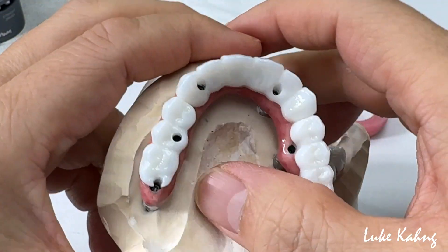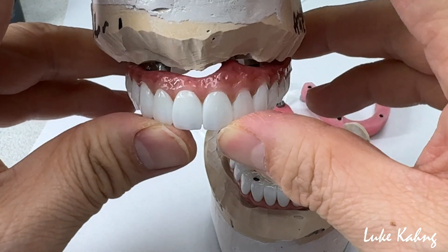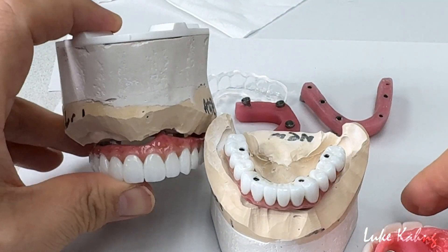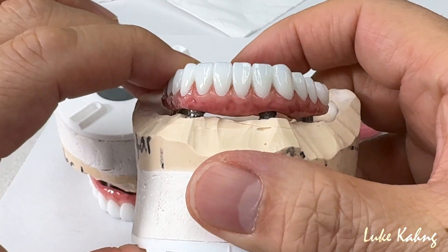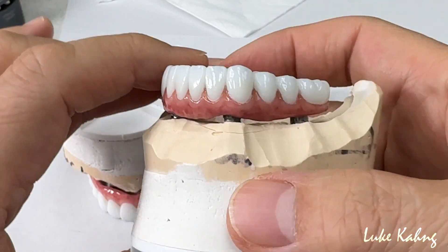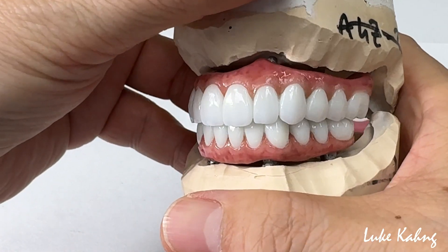A lot of people are still asking why I made the two pieces. It's really good for porcelain fracture resistance — it's tensile strength, same as here. So we put it in compared to my wax-up, and here's the final restoration.